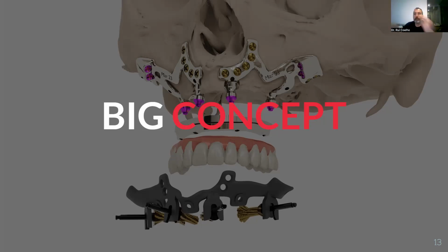But picking up the first concept that I told you about plates, what happens when a mid-face plate exposes, you find that there is inflammatory tissue, but every part of the plate that is below the muscle insertion is covered by bone. So for that we go here.